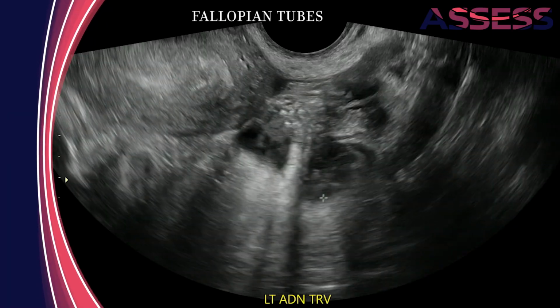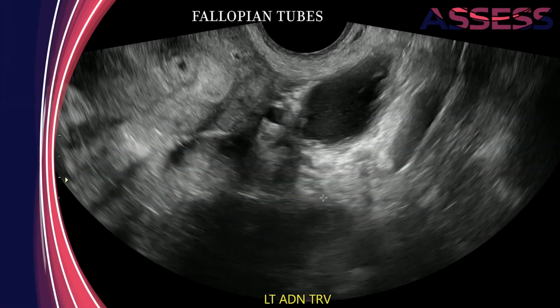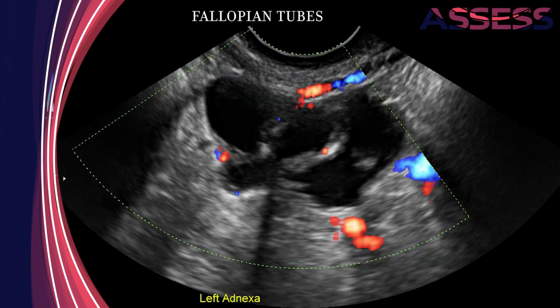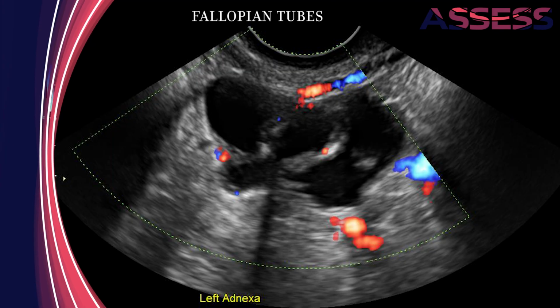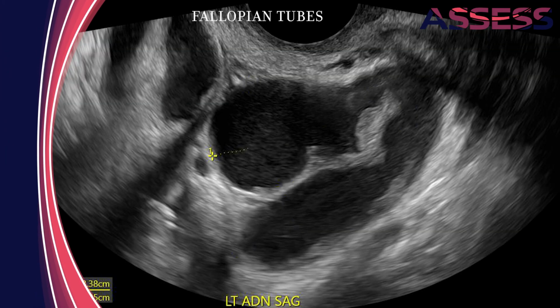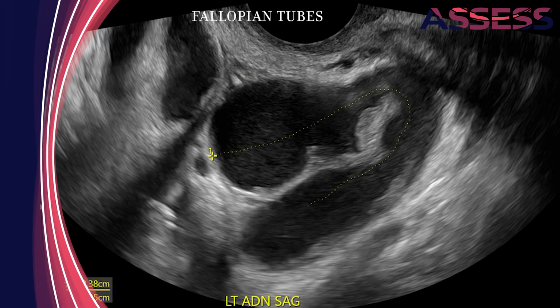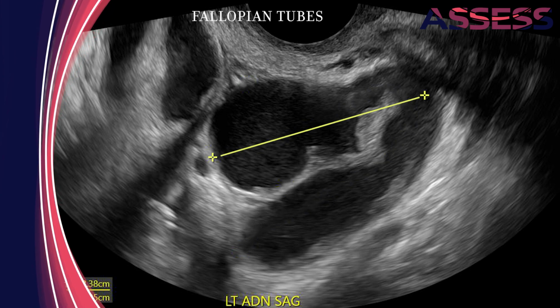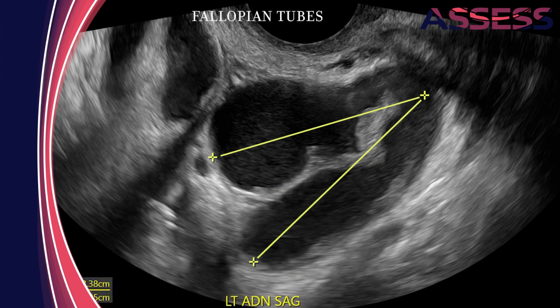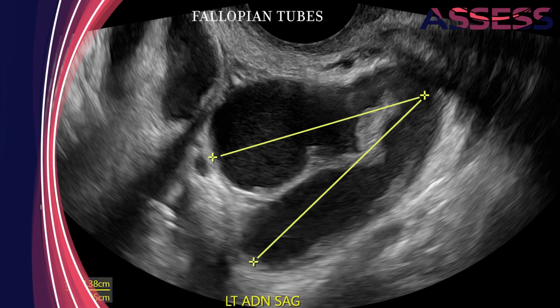A hematosalpinx will contain blood, which is a particulate fluid, causing the appearance of low-level echoes in the fluid. Color Doppler should be applied to demonstrate that the structure seen is not an enlarged blood vessel. The longest length of a hydro or hematosalpinx can be measured using a tracing caliper tool to best represent the actual length of the tortuous structure. Alternatively, multiple straight distances can be taken and added together to represent the true length of the fallopian tube. The diameter of the tube should also be measured at the widest point.